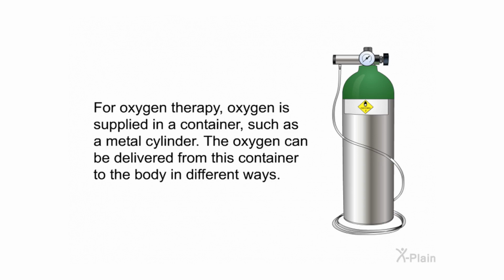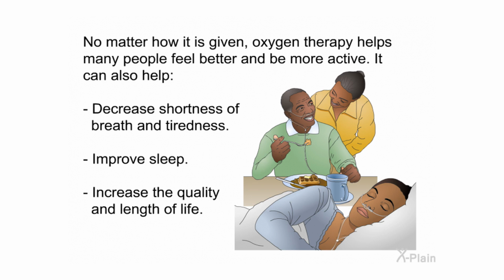For oxygen therapy, oxygen is supplied in a container, such as a metal cylinder. The oxygen can be delivered from this container to the body in different ways. No matter how it is given, oxygen therapy helps many people feel better and be more active. It can also help decrease shortness of breath and tiredness, improve sleep, and increase the quality and length of life.